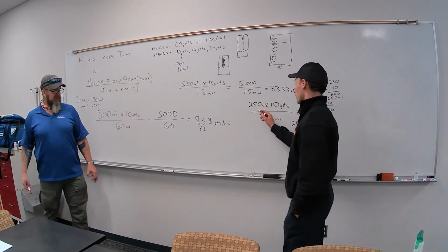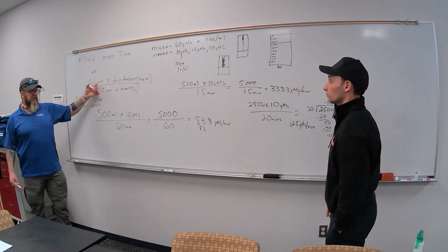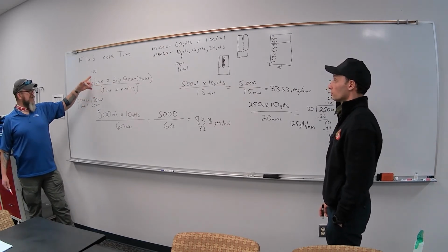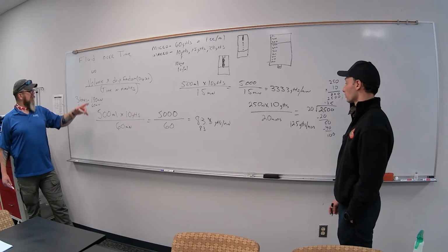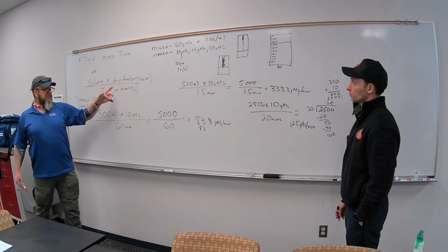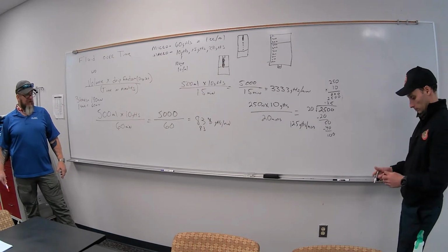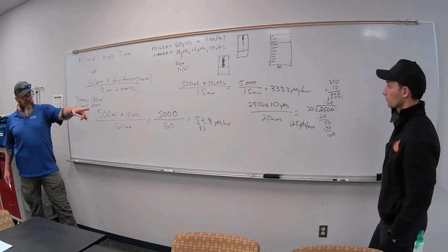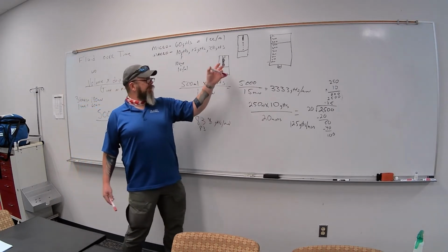So this would be like a doctor's order, giving a patient 250 mL, or if you were just giving a fluid bolus, right? You don't necessarily need doctor's orders to give fluids. You've got standing orders, you've got protocols, that kind of thing. Hypovolemic patient, I'm going to give him a 250 mL fluid bolus, and I want to give it pretty rapidly over the next 20 minutes between now and the hospital. So what kind of drop rate do I need? That would give me 125 drops per minute, which is pretty fast.